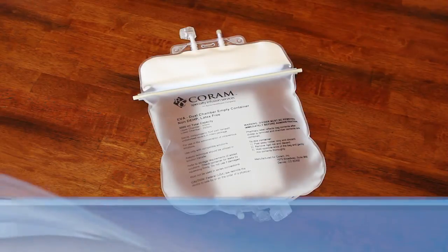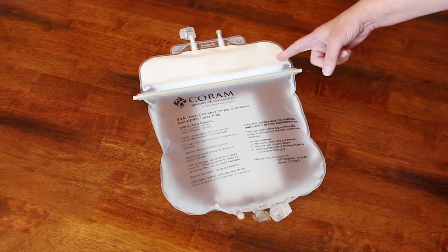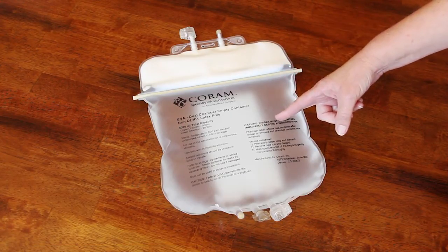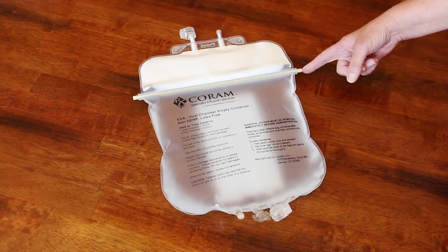In the dual chamber bag, your TPN solution is divided into two chambers. The milky white fat part of the TPN is in the upper chamber of the bag. The clear protein and carbohydrate part of the TPN is in the bottom chamber. A divider rod slipped over a rubber strip separates the two chambers.